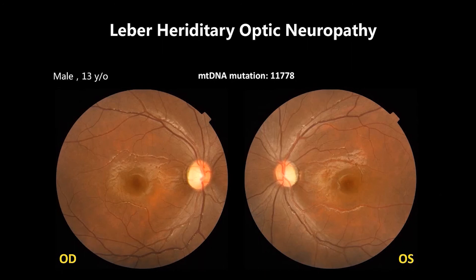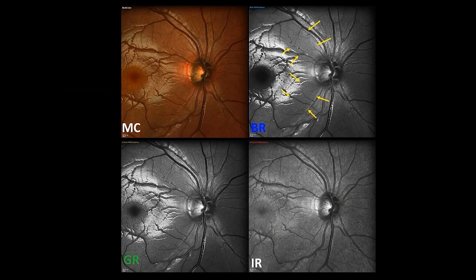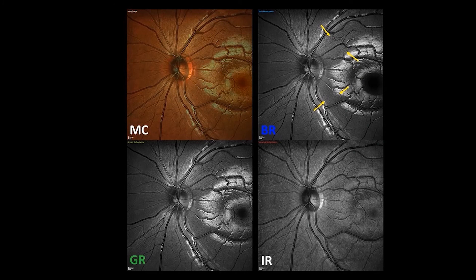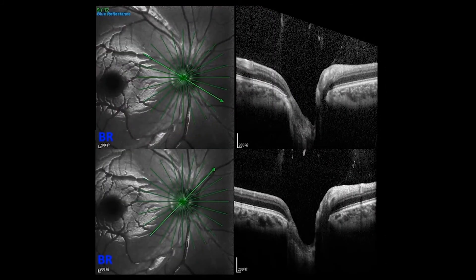The last case is Leber hereditary optic neuropathy. You may notice that the temporal portion of the disc is pale on each eye. The mitochondrial DNA mutation site was 11778. The blue reflectance showed the retinal nerve fiber layer defect obviously on both eyes, with OCT confirming the defects.